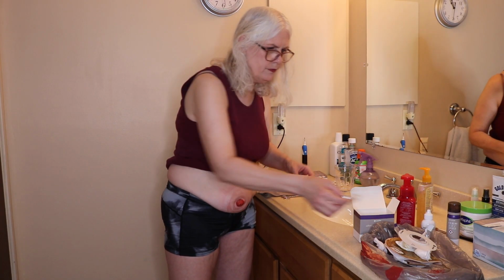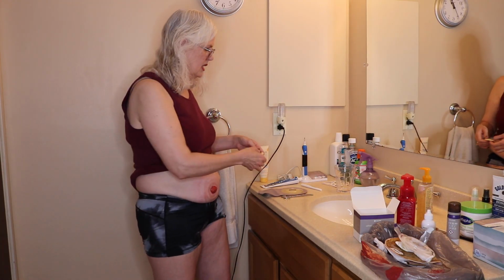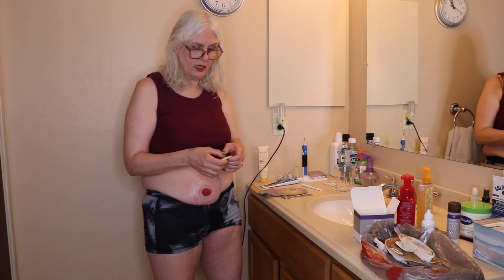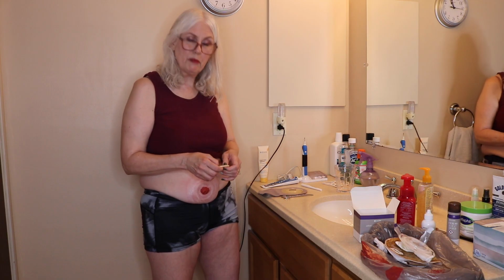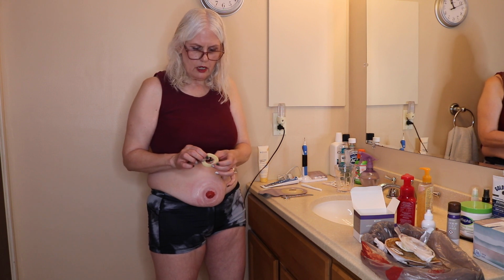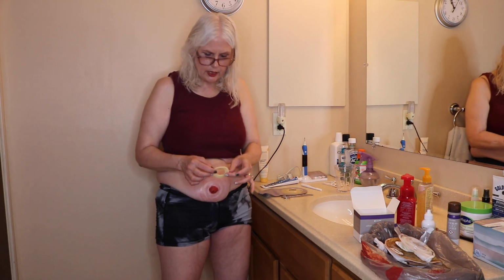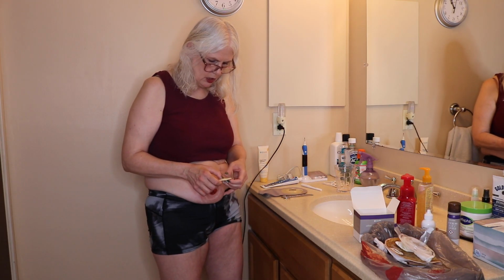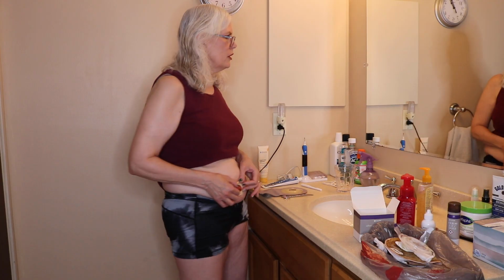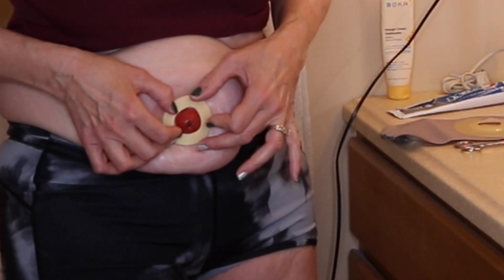Now when I first had this in the hospital, they told me to get the ring big enough and put it on the bag and then put it all on at once. Then there was a time I was wondering, because of all the barrier ring I was having, I wasn't seeing any other videos where anybody else was having that problem. So I went to see the ostomy nurse, and I happened to have a leak that day, my first leak. So she was all excited about that. She told me to take this ring and put it right on the ostomy, or around it, so that you have a nice solid barrier around the ostomy. So you know that it's protected, it's covered.